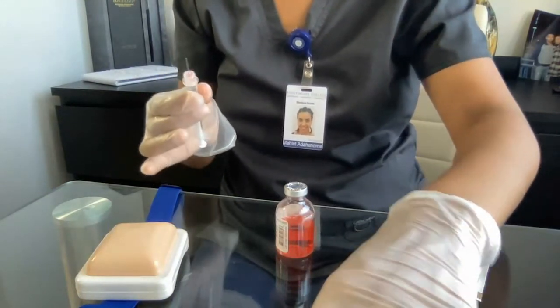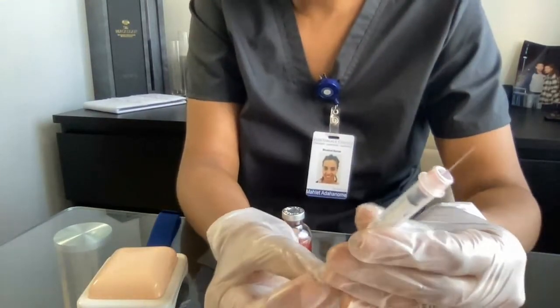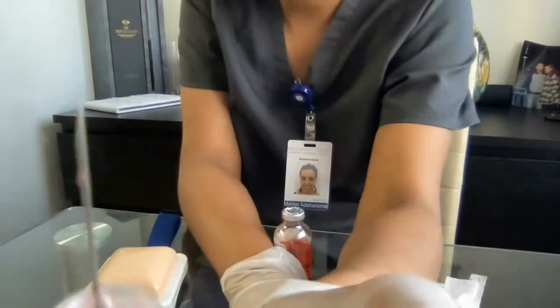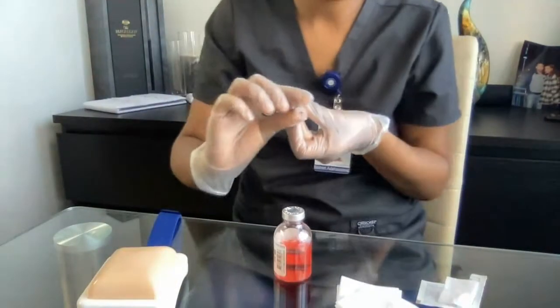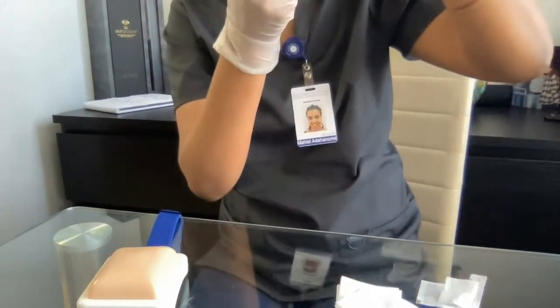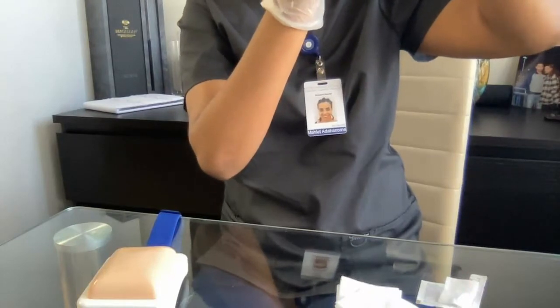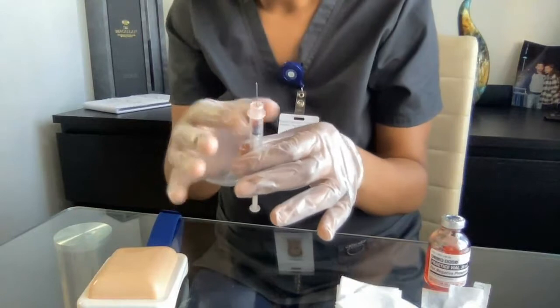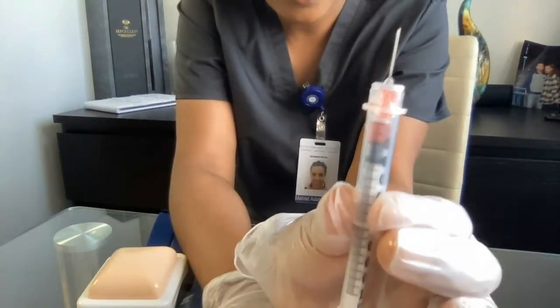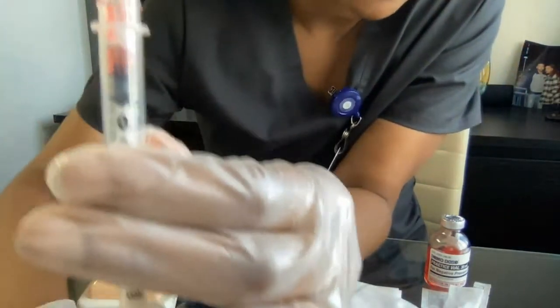I'm going to be administering 0.1 milliliter, so I'll draw 0.1 milliliter of air into the syringe, inject it into the vial, let the air come out, and then draw 0.1 milliliter of medication — because that's what the doctor ordered. I make sure there are no bubbles. As you can see, I have 0.1 milliliter drawn up.